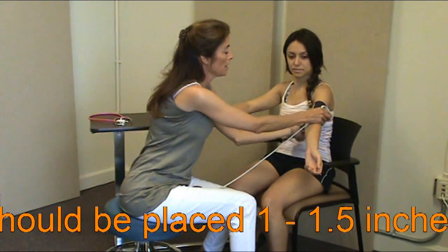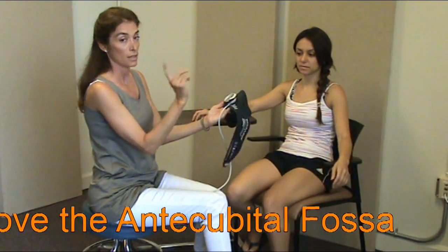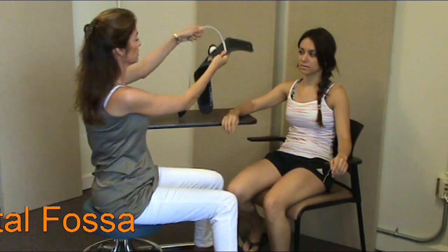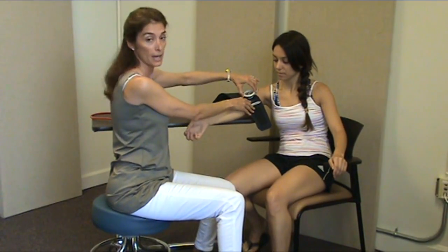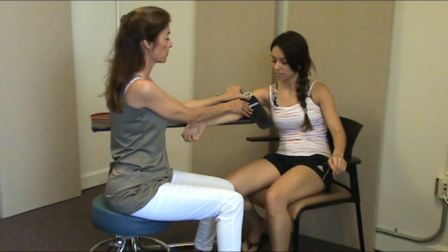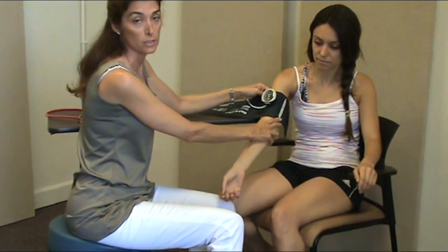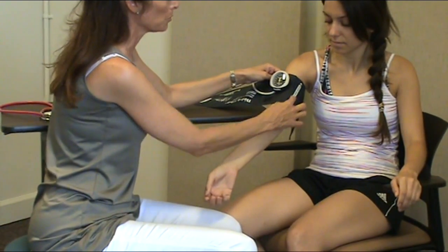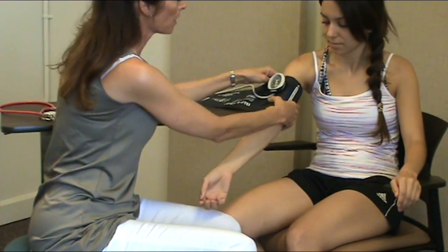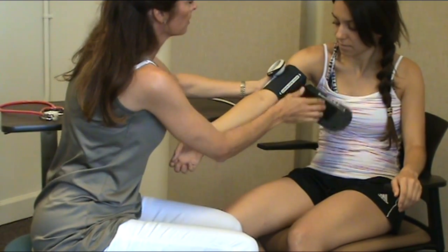Okay? Now, when you want to use it on the opposite arm, the incorrect technique would be to put it on like this with it upside down. You would have to turn the face so that it is facing the correct direction. So then you're going to palpate the brachial artery, place the arrow on top of that artery, and then fit the blood pressure cuff snugly around the arm.